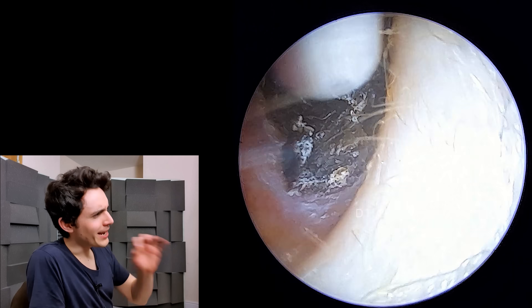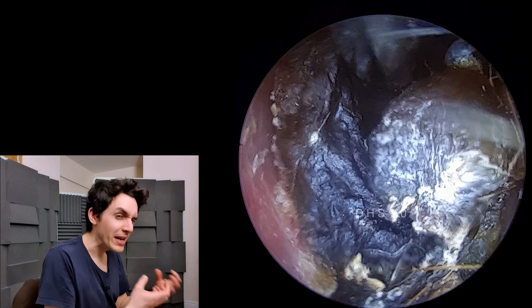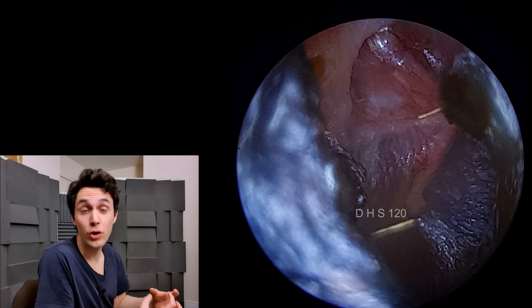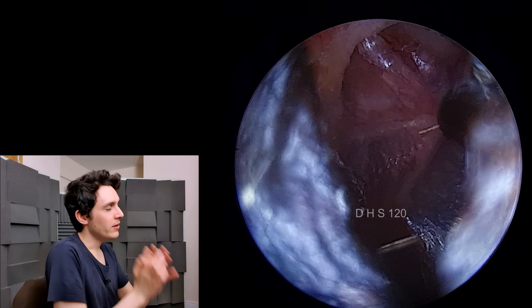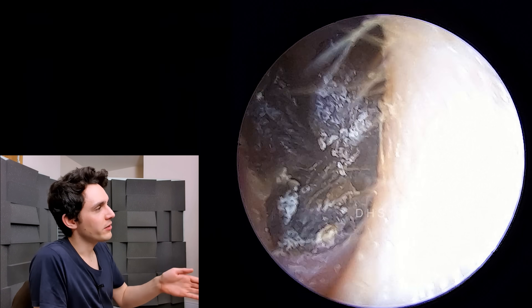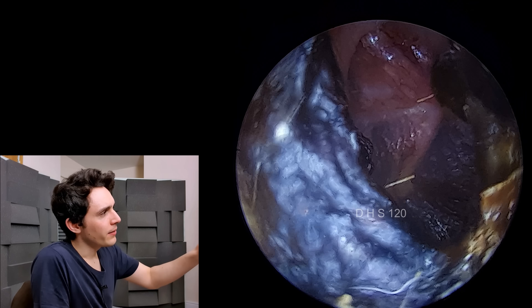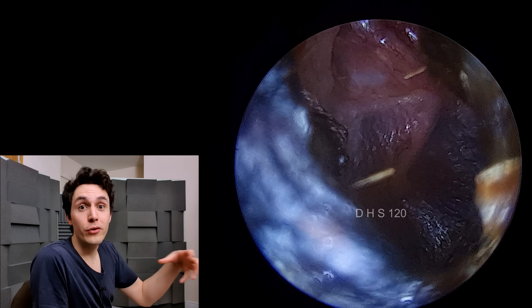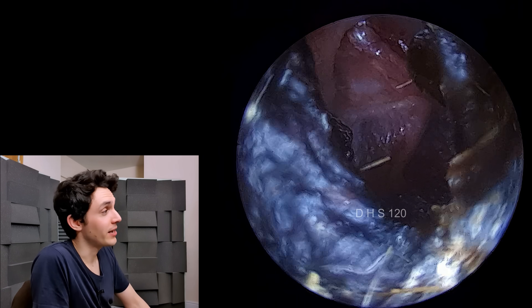As you can see there's some very very black debris in the ear which is likely to be old wax and maybe a little bit of dried blood, and it's in this v-shaped configuration. I'm very luckily able to kind of push the wax to the side and look through with the endoscope. We can see an eardrum back there, but there is a heavy amount of retraction which I'll explain about in a moment — that is a noted complication of the case.